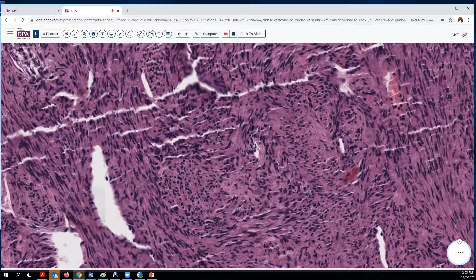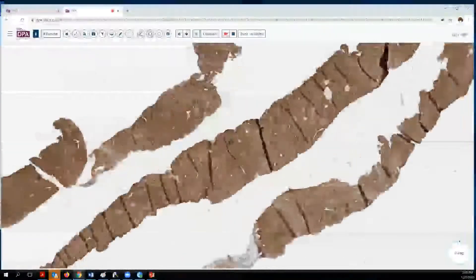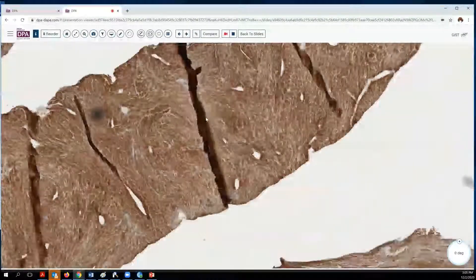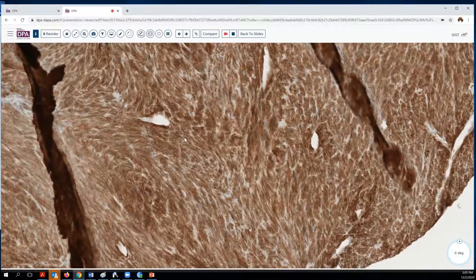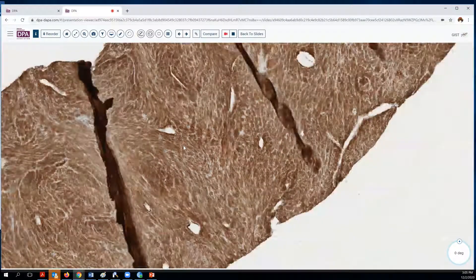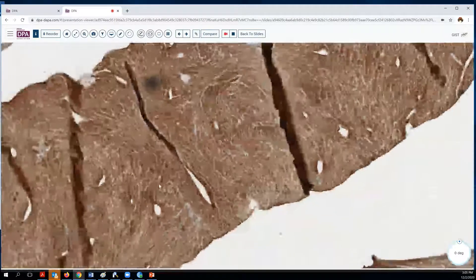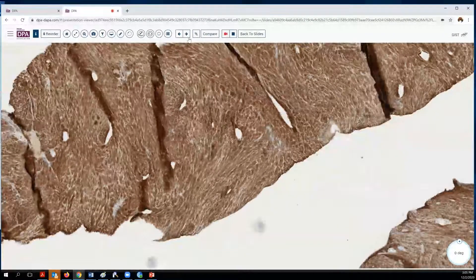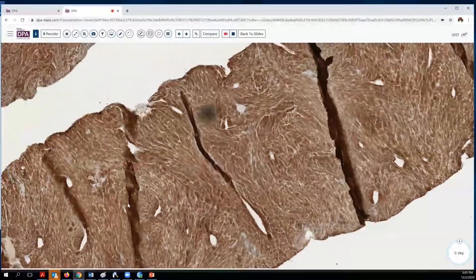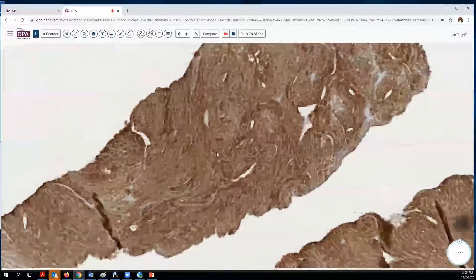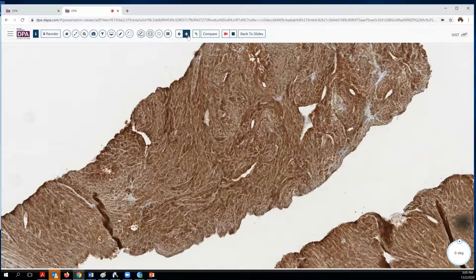Here we can see again this nice streaming, coarse spindle-shaped cells, and again no mitotic activity. Here is the immunohistochemical stain — this is DOG1. DOG, of course, stands for Demonstrated On GIST. The CD117 stain was similarly strongly positive throughout the tumor, which makes our diagnostic considerations fairly easy. Muscle markers and nerve markers were understandably negative in this situation.